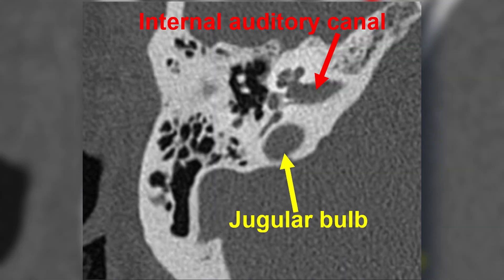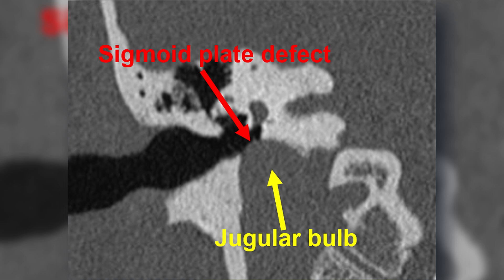On a more superior axial section, the internal auditory canal is observed and the jugular bulb remains visible, confirming the presence of a high jugular bulb. On coronal reconstruction, a high jugular bulb with a defect in the sigmoid plate is evidenced, a finding compatible with a dehiscent high jugular bulb.